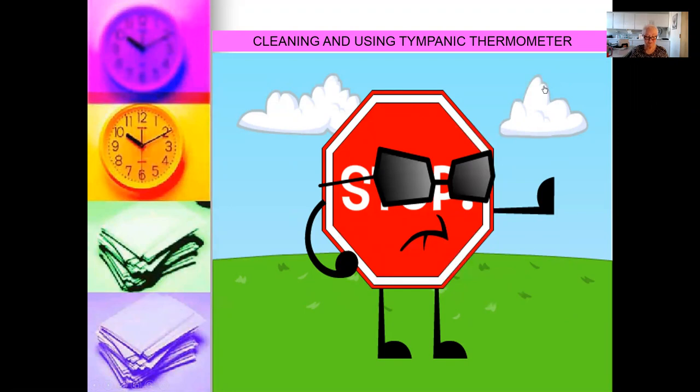Clean the probe and the tip of your thermometer with an alcohol swab or an ear swab dipped in isopropyl alcohol after each measurement. This will ensure the most accurate reading. To clean the body of the ear thermometer, you may use a soft, dry cloth. Do not use abrasive cleaning agents, thinners, or benzene for cleaning.